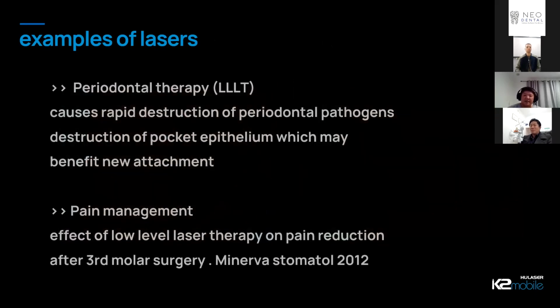And there are some other examples that I don't personally use, but if you're periodontally inclined, there's a lot of research about low level laser therapy, and it helps clear up the pathogens in the periodontal pockets, as well as pain management. That's quite an interesting paper, how using a laser actually produced better post-operative pain levels.